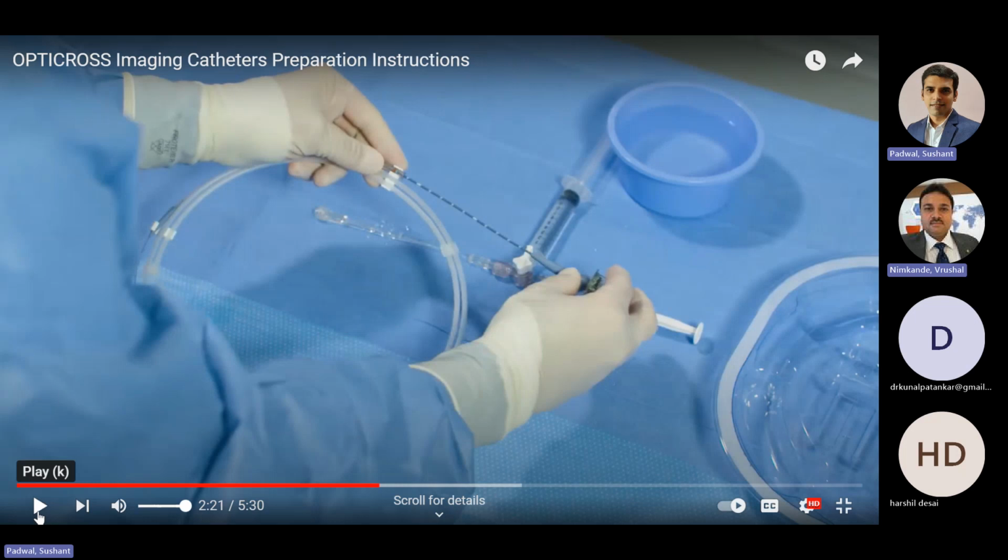Some operators are comfortable just referring to the angiographic image, where they want to land the distal edge of the stent. Suppose there is a D2, diagonal 2, and from diagonal 2 to diagonal 1 they wanted to have a focal length. Then simply you park your transducer at diagonal 2, start the pullback till diagonal 1, and just measure the number of dots which are pulled out.